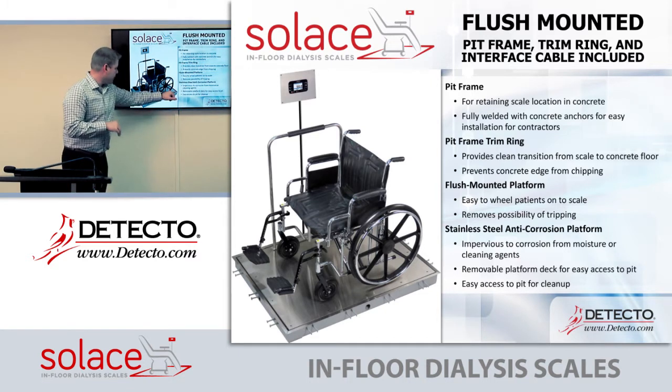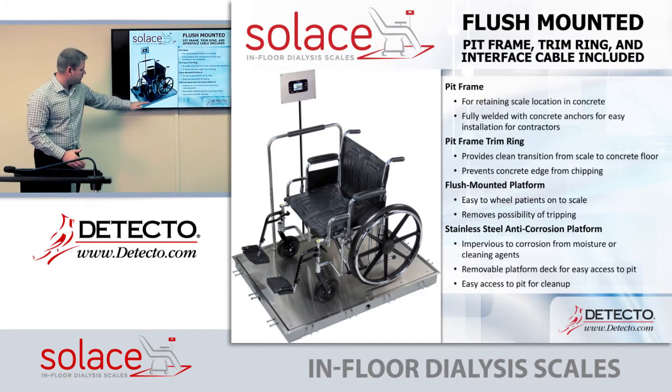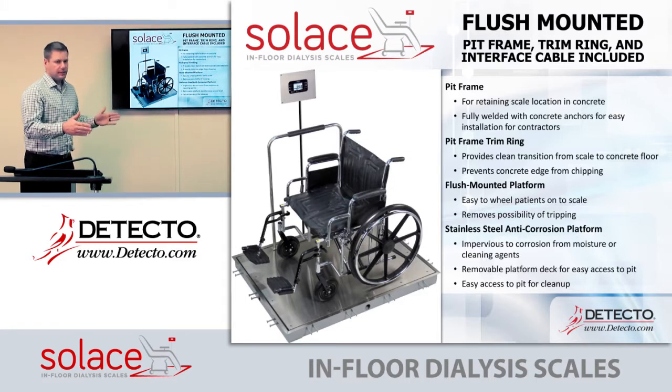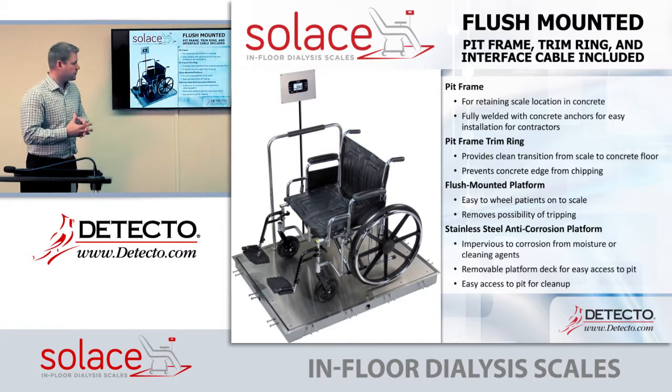The trim ring around the outside creates a very smooth transition from the concrete to the scale. With past and competitor scales, it's simply an angle iron coming up. Our trim ring also prevents any chipping of the concrete, which competitors don't provide.